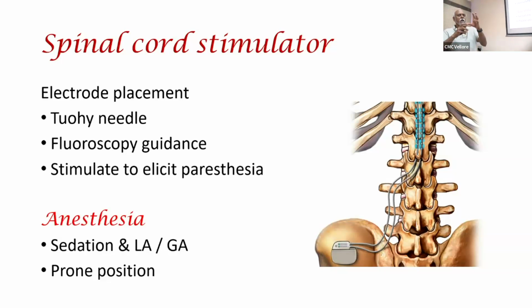Now you can predetermine what level you want it, because depending on where the pain is, and leave it like that. Or when you put it, you stimulate and ask the patient, are you getting paresthesia in the same place where the pain is? Then of course it works well. So you can have an awake patient or asleep. Many surgeons, it depends on how the patient's acceptability is. So it can be done.